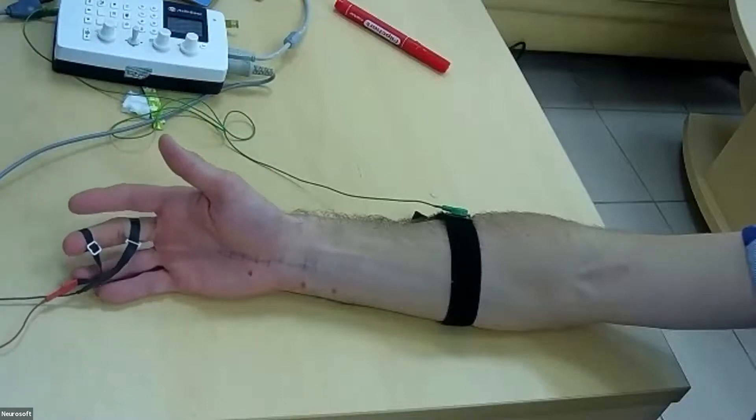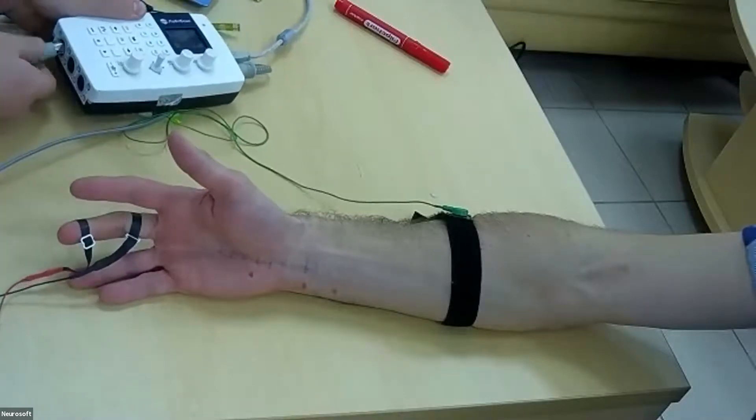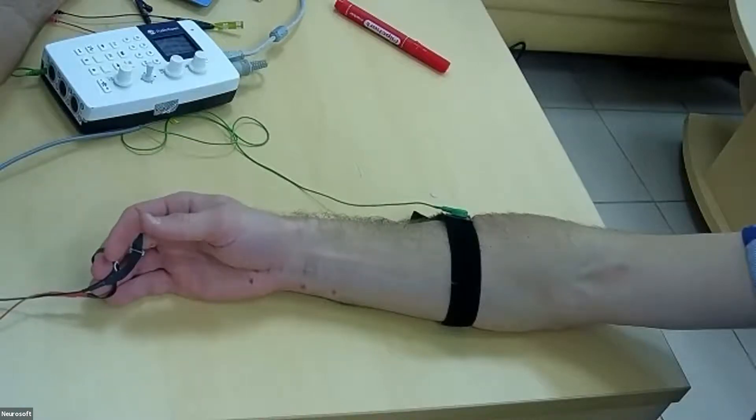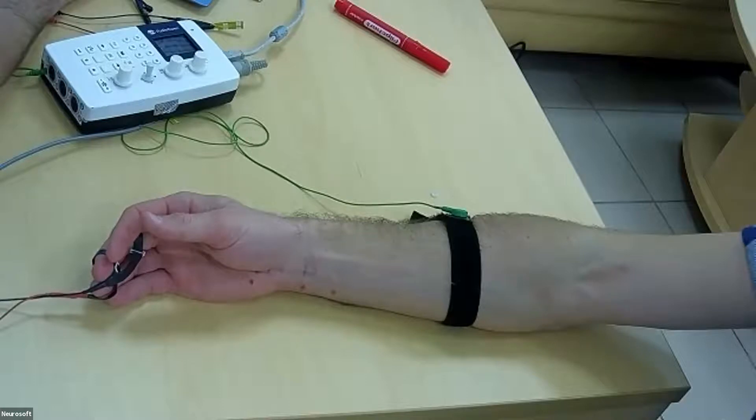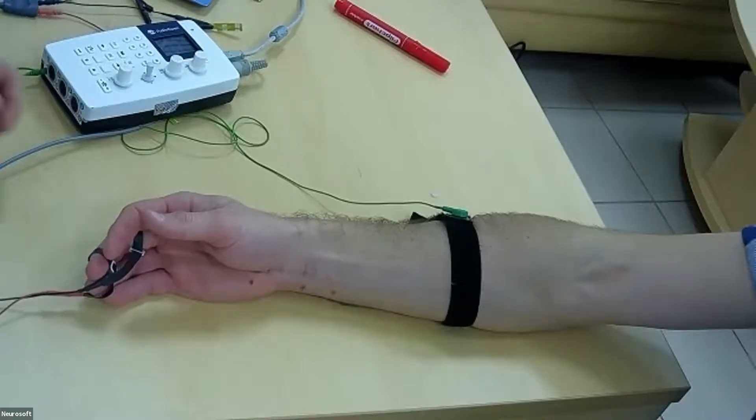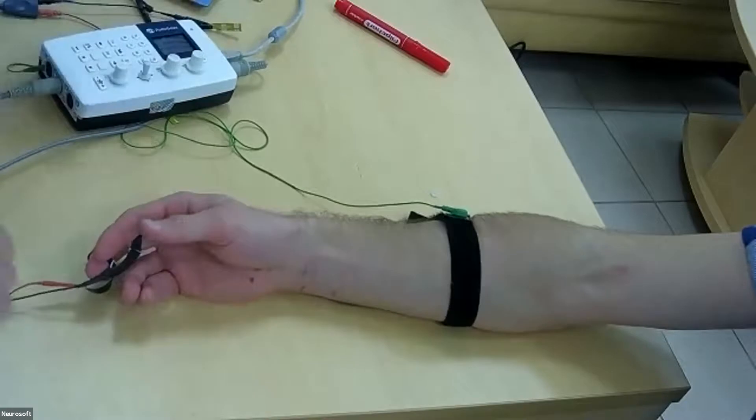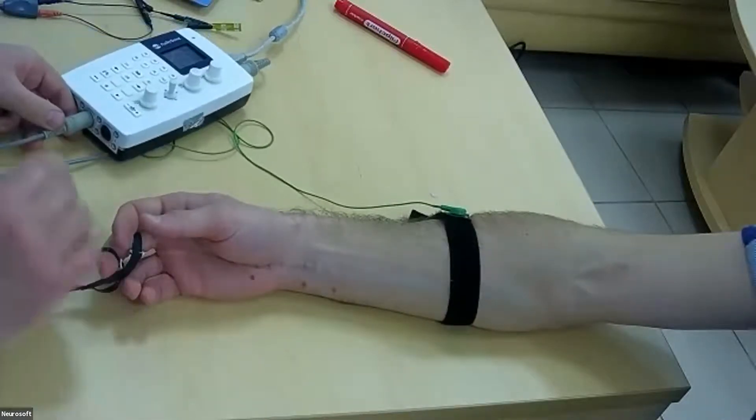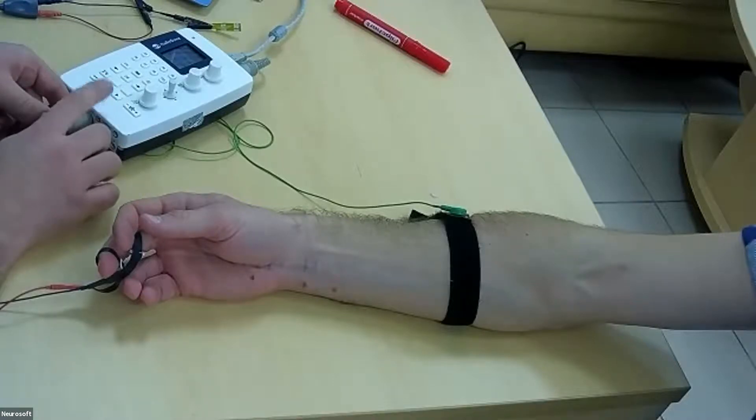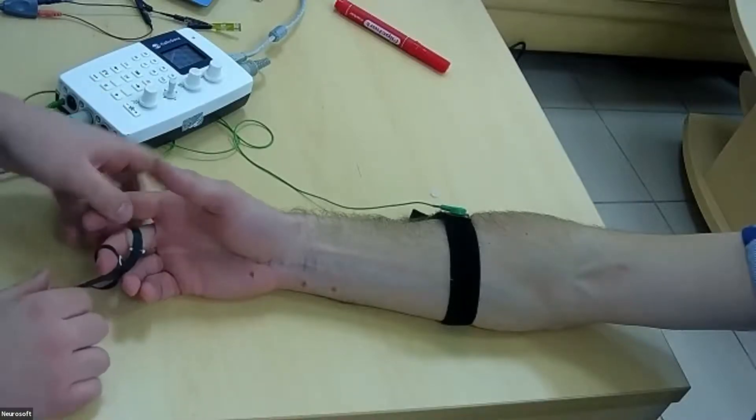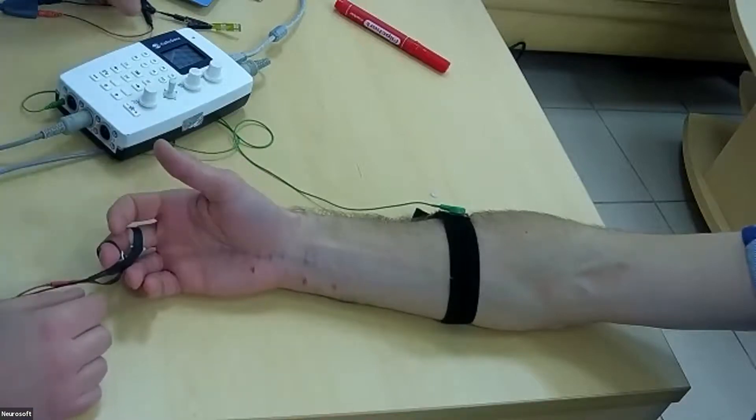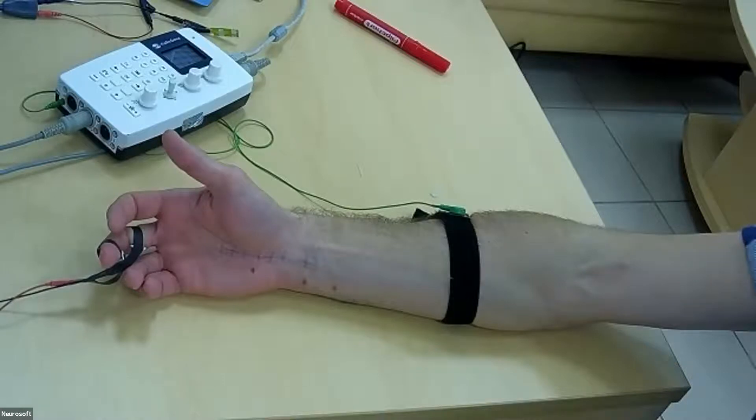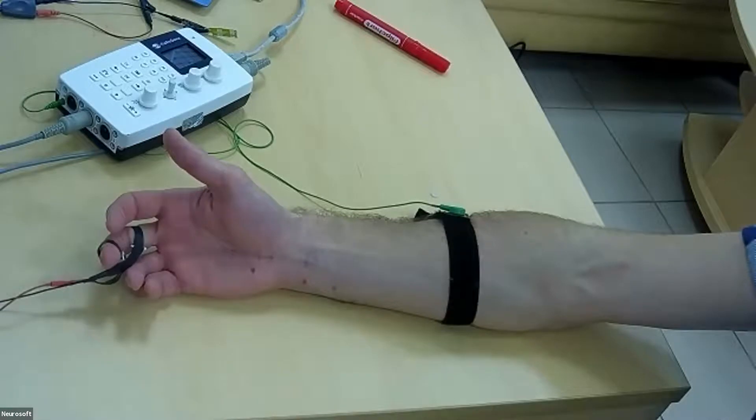By default, all sensory neuroconduction studies are set in second channel in this machine. So we will stimulate with bar electrode. We can leave at the same place our ground electrode.